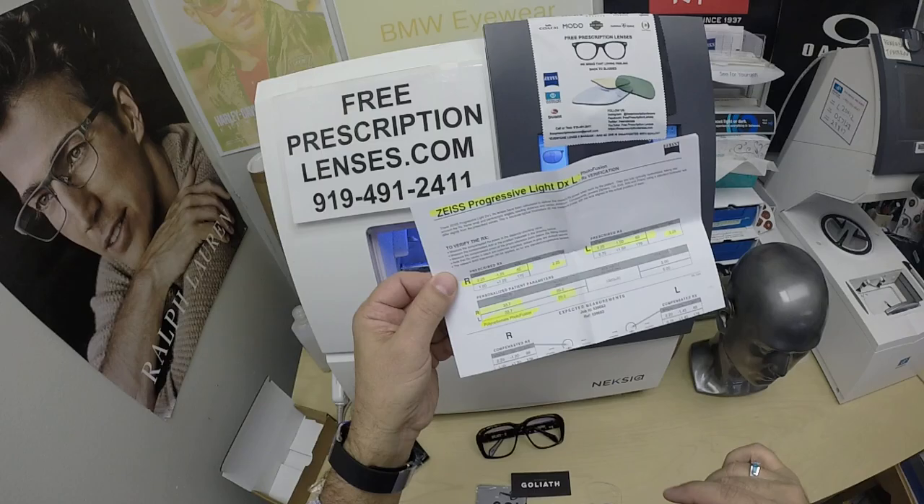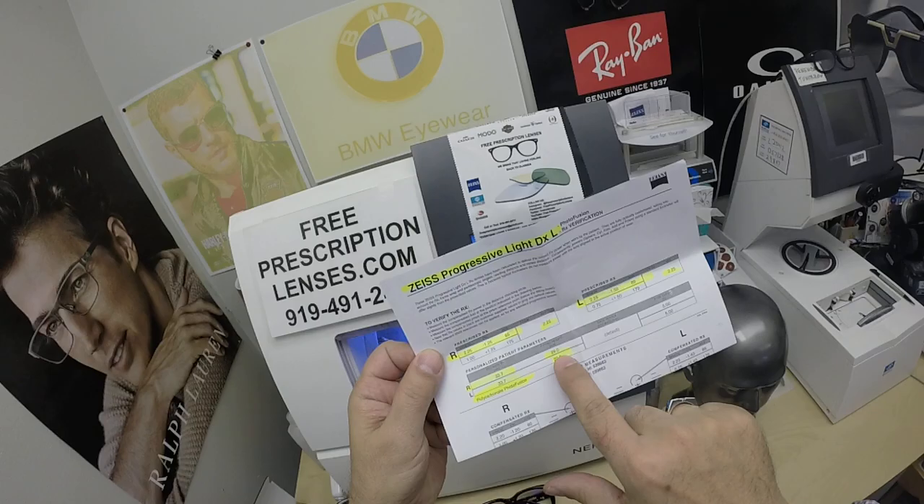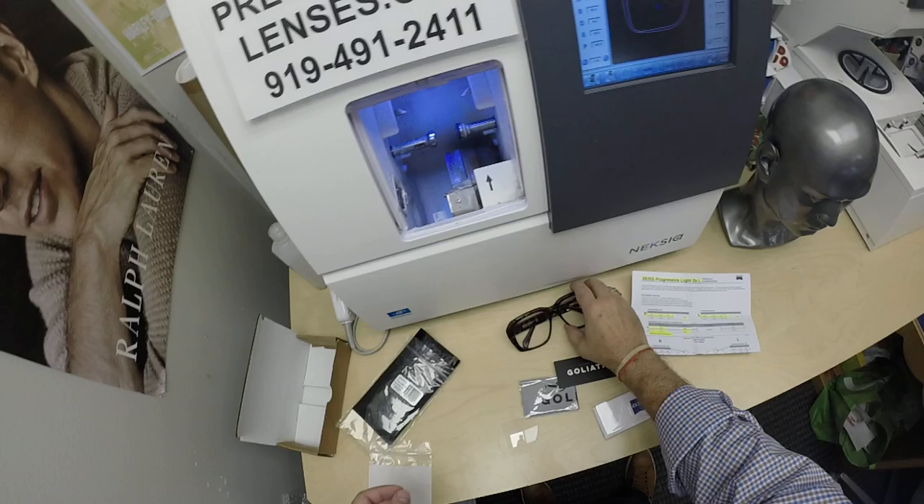He's getting the Zeiss Light D digital free-form progressive lenses. I've highlighted the prescription for the right eye — the add power — same for the left. Pupillary distance, optical center height. He's getting the Zeiss Photofusion Gray with DuraVision Platinum.